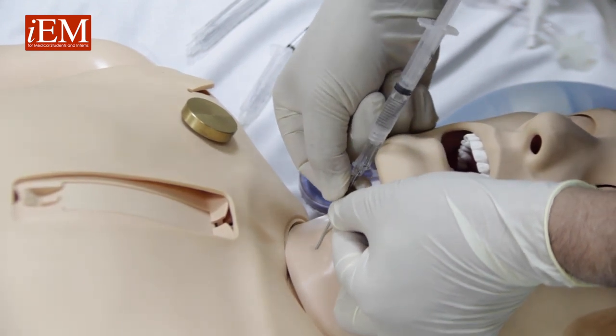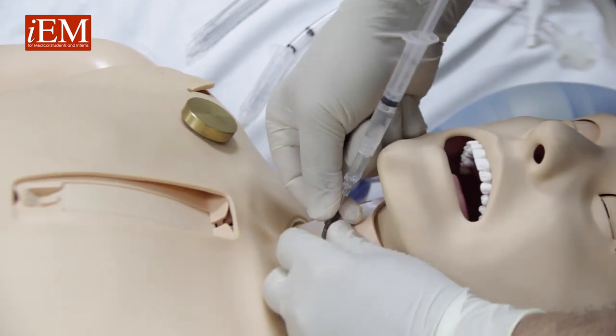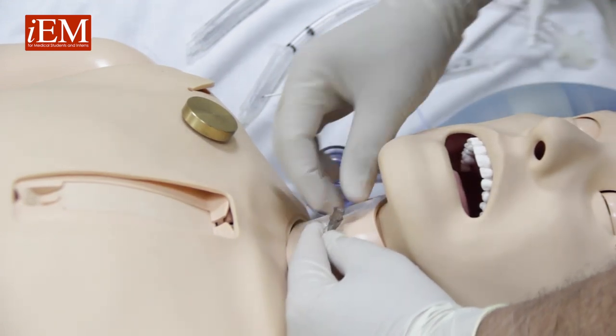Then you advance, pull the needle out, advance your catheter in, and now we're inside the airway. Hold your catheter in place and remove the needle.